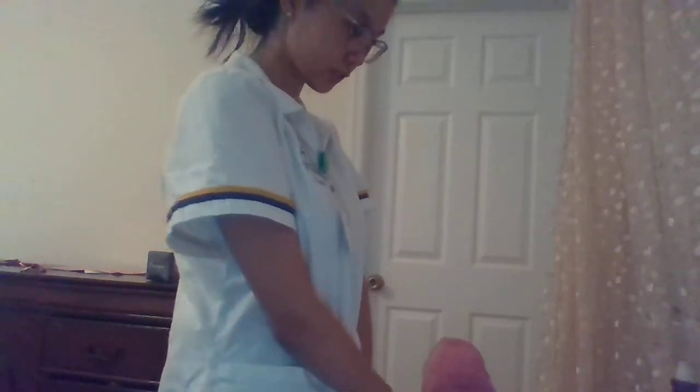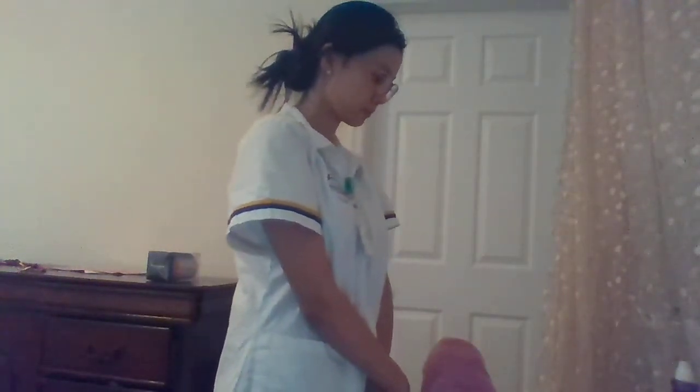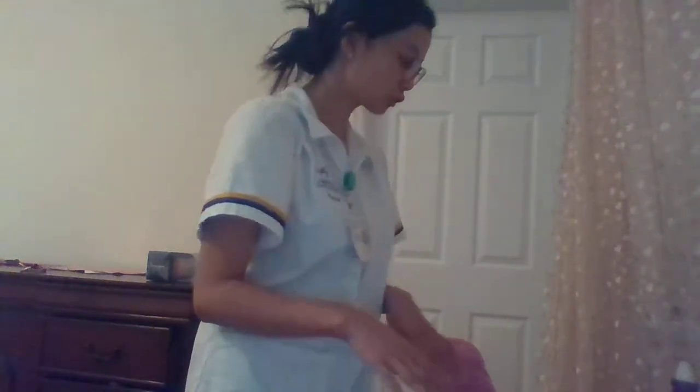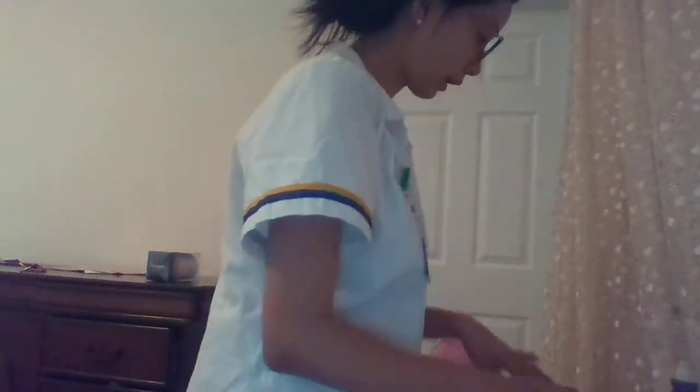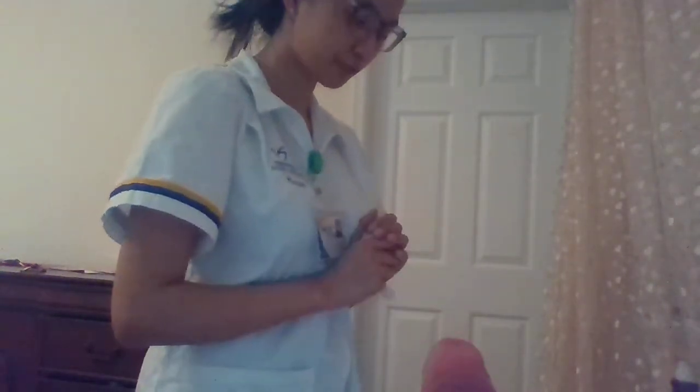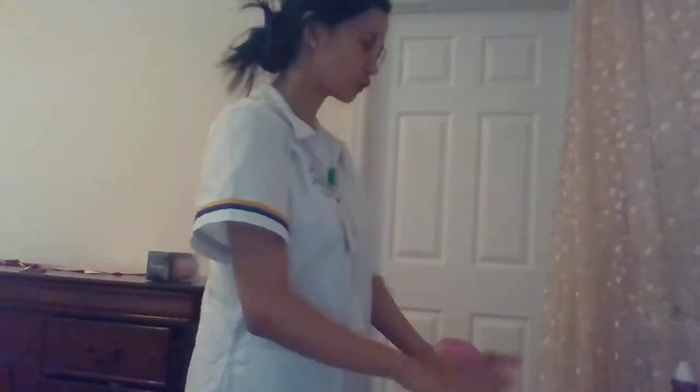And the route is intramuscular, and I'm going to document it after I check the 6 rights. I need to check my medication, influenza vaccination. Okay, and I'm going to document after that.